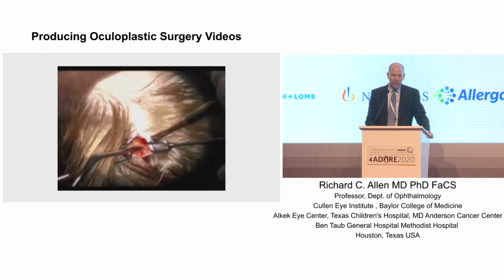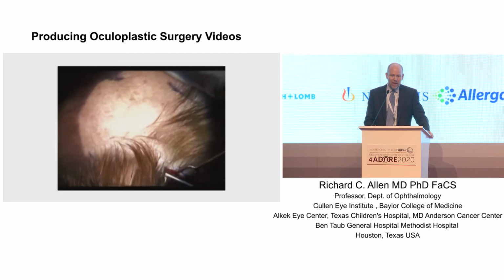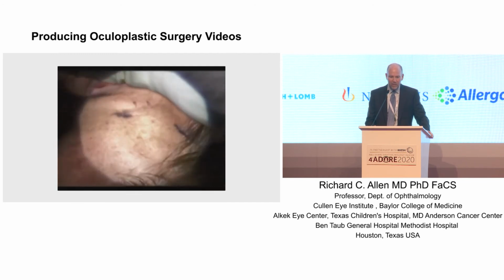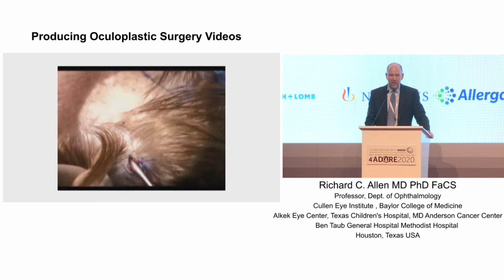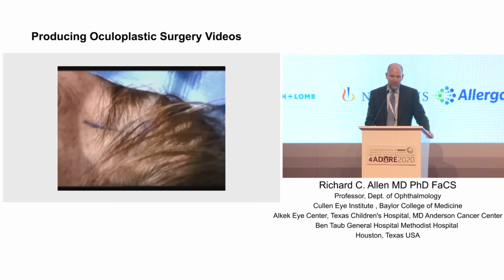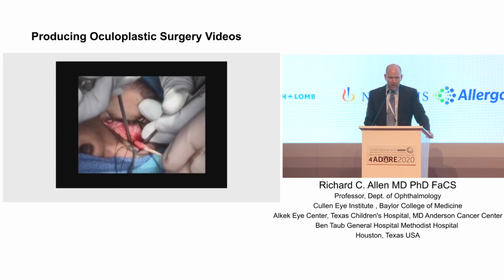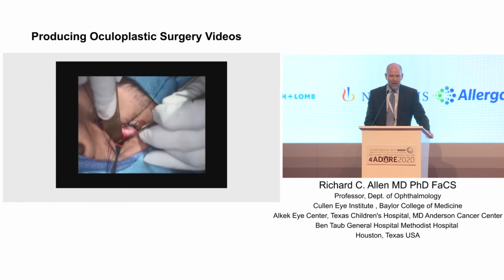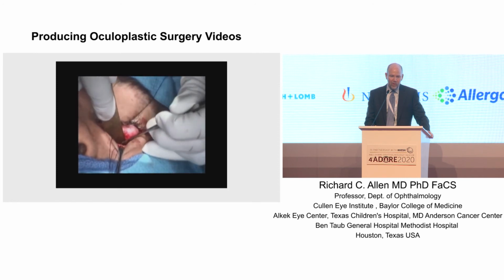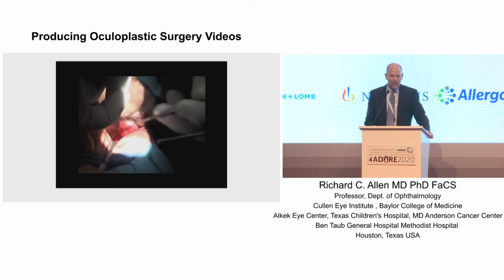And this is just a patient where we're doing a small incision browplasty without the endoscope. And a lot of movement though, and you sort of have to consciously keep your head still in order to get a video that's going to be usable. If there's too much movement, it's unpleasant to watch. Maybe all these are unpleasant to watch. But again, another example of an overhead camera where we're trying to show the orbital floor, but again, having difficulty demonstrating that.